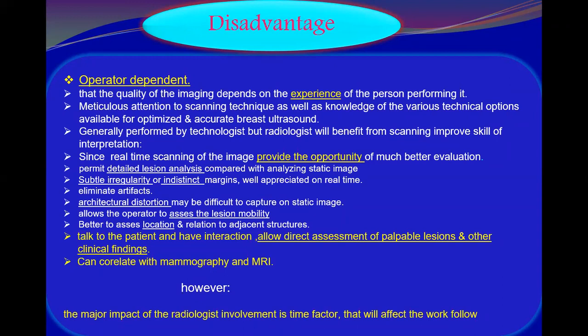Why? Because definitely real-time scanning is not like the static image. It provides a lot of opportunity that improves the interpretation skills. It permits detailed lesion analysis compared to the static images regarding subtle irregularity, as you have seen in indistinct margins.